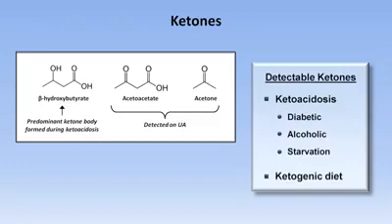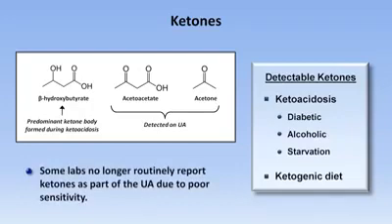At peak severity, the ratio of beta-hydroxybutyrate to acetoacetate may be 10:1, greatly reducing sensitivity of the dipstick for clinically relevant ketoacidosis. This is why many labs no longer report it. An interesting phenomenon can be seen with treatment of ketoacidosis in that clearance of the undetected beta-hydroxybutyrate requires it to be first converted to the detectable acetoacetate. So as a patient is actually improving, the urine ketones can switch from negative to positive, giving the false impression the condition is worsening.